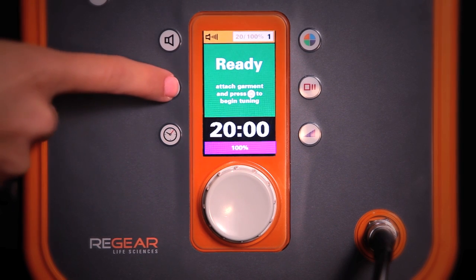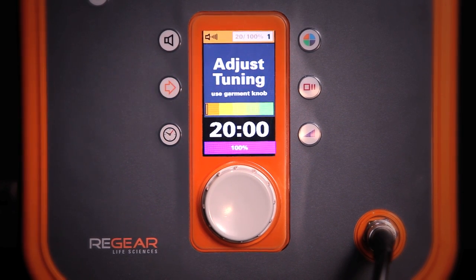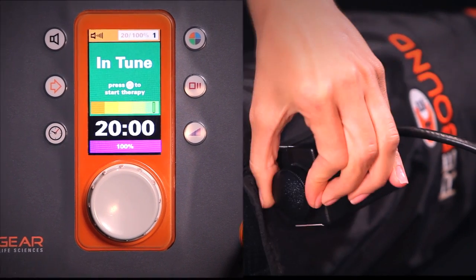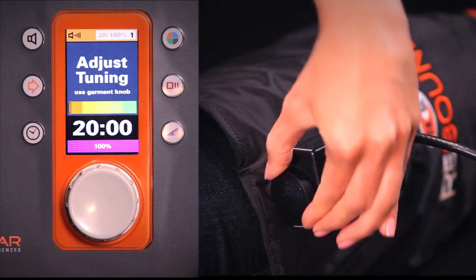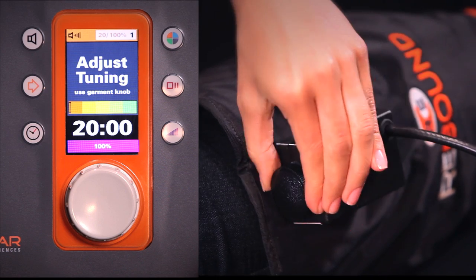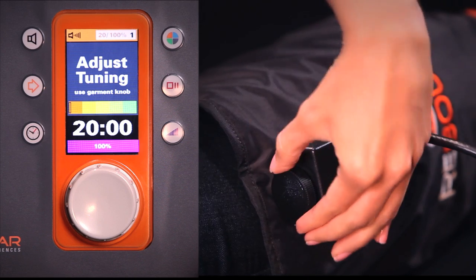Once you press the continue button, you'll be on the tuning screen, and Adjust Tuning will be displayed along with the bar graph that starts out red and progresses to dark green. Your goal is to get the indicator bar as far into the green as possible. To do this, start turning the black knob on the garment. Each knob can be turned a total of either 10 or 3 times, depending upon the garment you received.